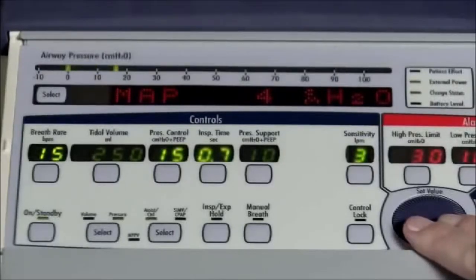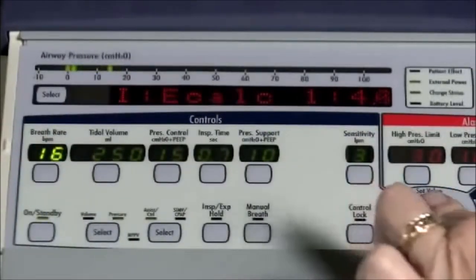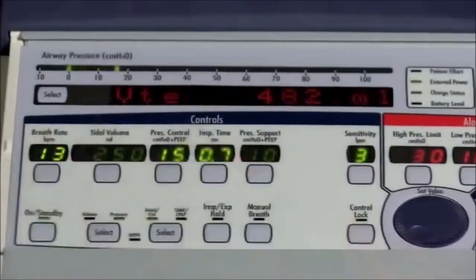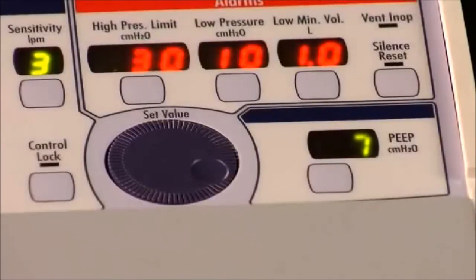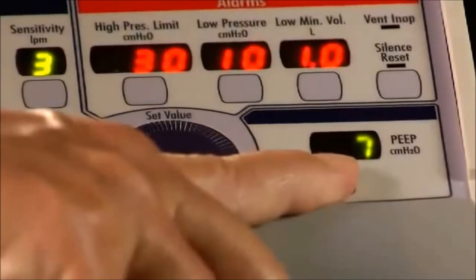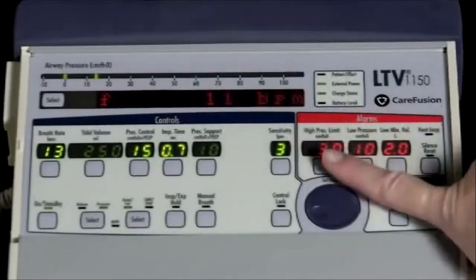Now we come to the set value knob, which is used to change the control settings and also to navigate the extended features. Turning the knob clockwise increases the values; counter-clockwise decreases the values. The last button in the bottom row is the PEEP control. To change the PEEP value, push the PEEP control button and change the setting using the set value knob. The final group of controls are for the alarm functions of the LTV 1150, located above the set value knob.